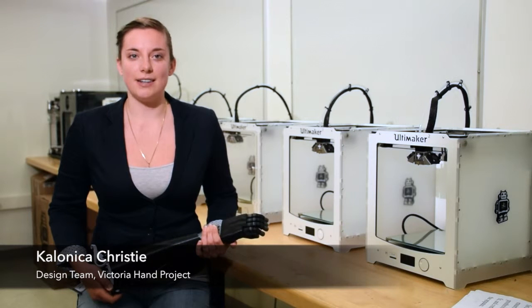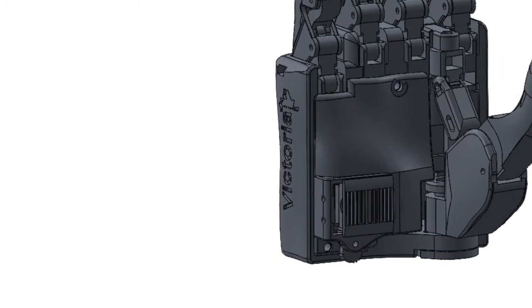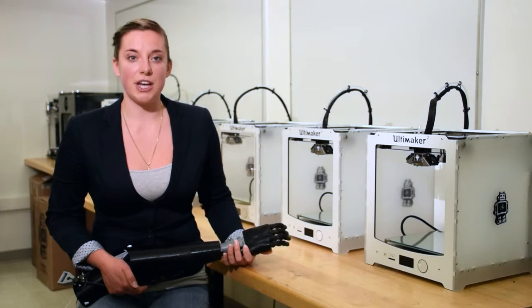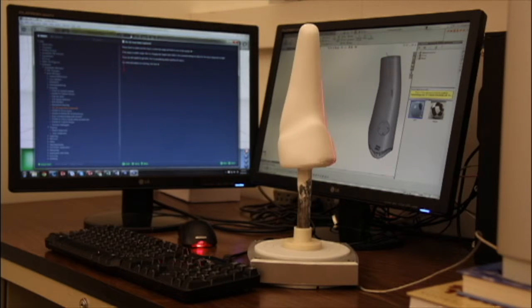We reinvented the early design using 3D printing and 3D laser scanning to create a low-cost upper limb prosthetic system. Using 3D scanning to capture the shape of the patient's remnant limb, we can 3D print a custom socket for each amputee. This ensures that the prosthesis is properly fit and comfortable for each patient.